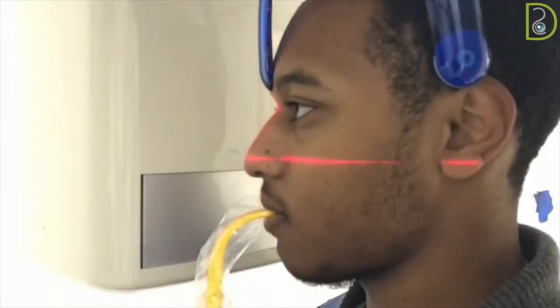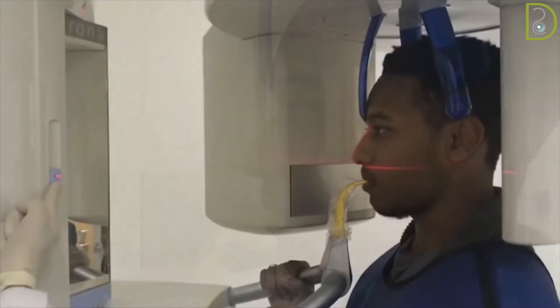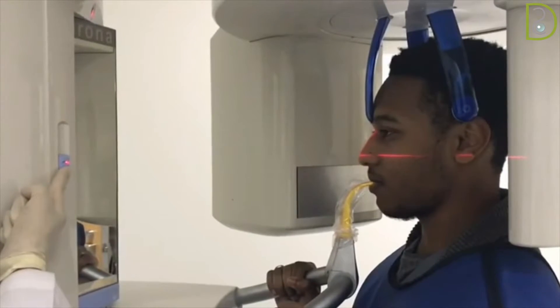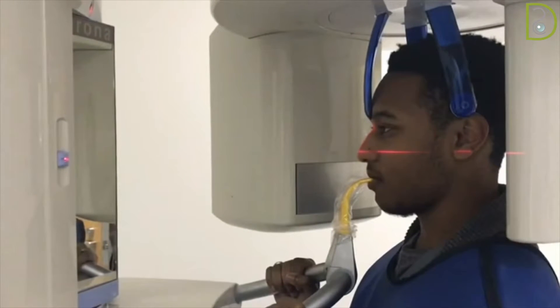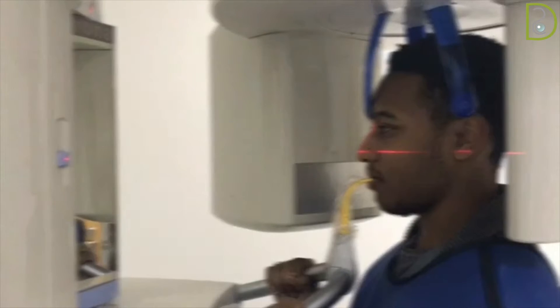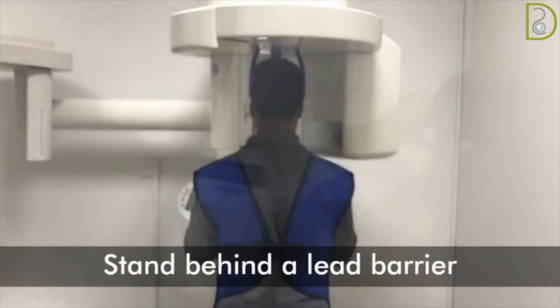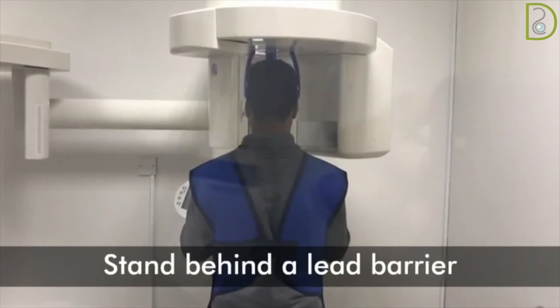The mid-sagittal plane should coincide with the vertical light beam, while the Frankfurt plane should coincide with the horizontal light beam. Finally, the patient is ready for exposure.